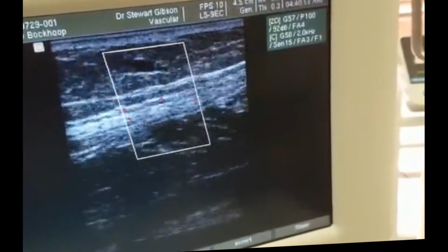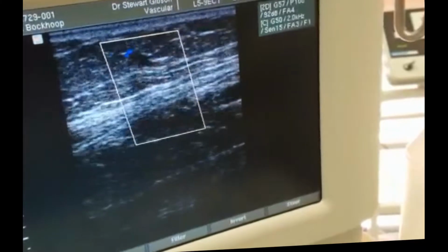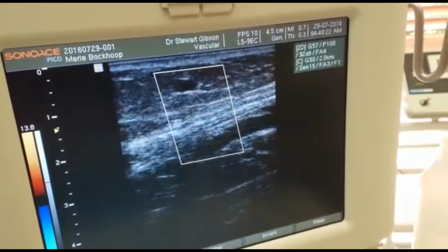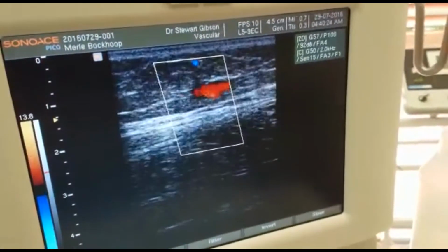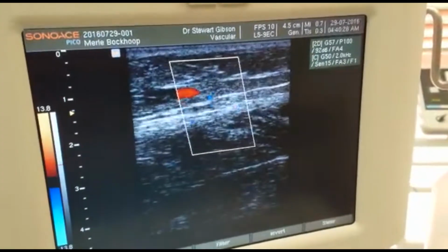We go back to the screen again, you'll see exactly where we are there. And then coming anteriorly again, you can see there's definitely a connection feeding into the great saphenous vein. That is a connection between those two truncal varicosities, so the pulsation may very well be coming from a posterior arteriole.